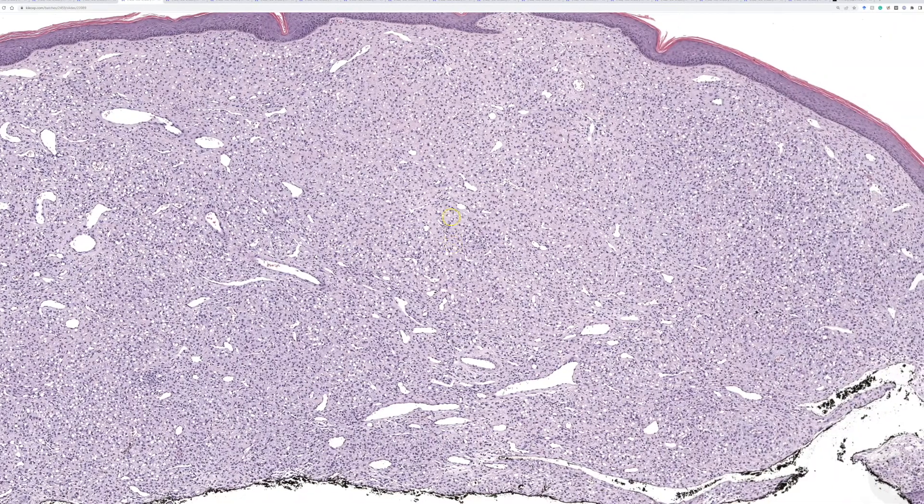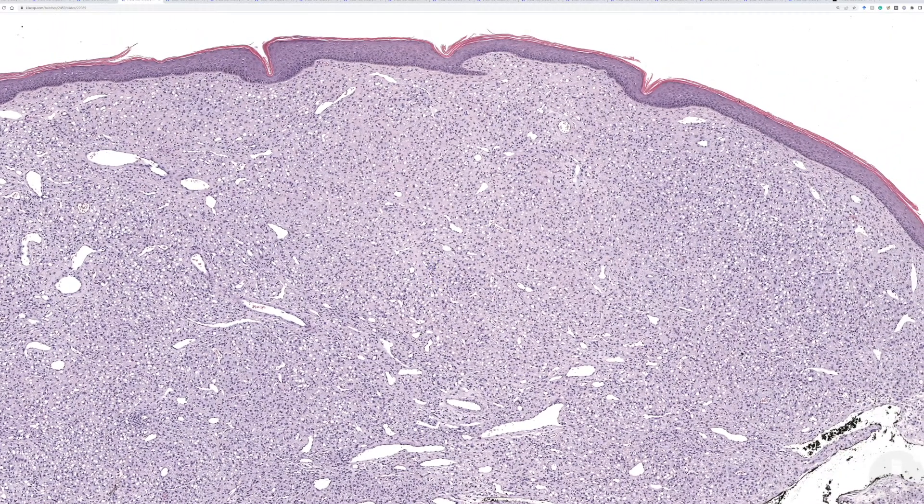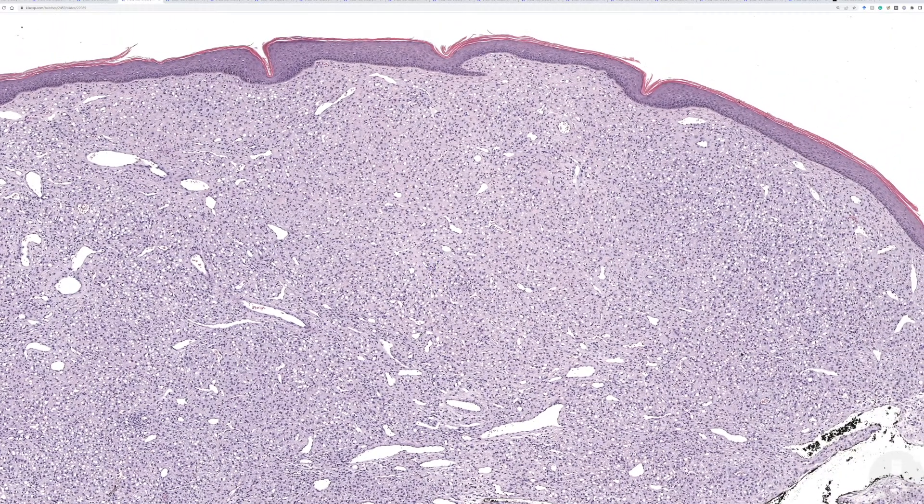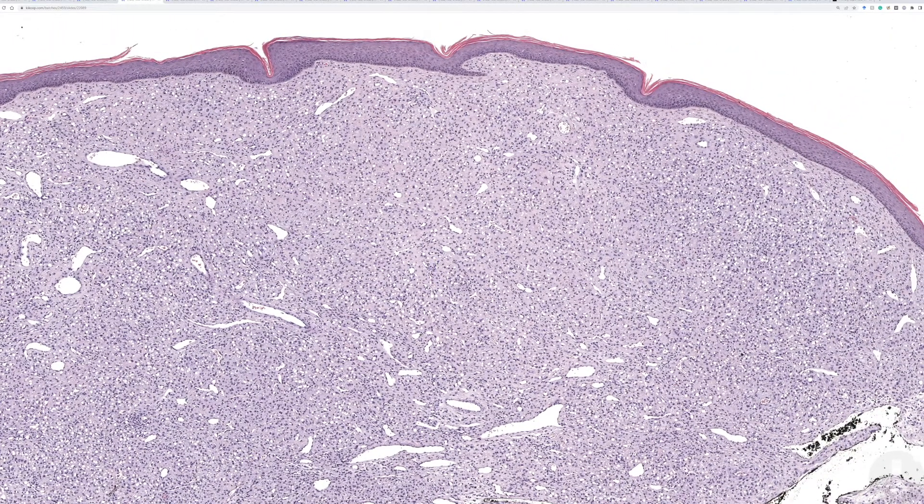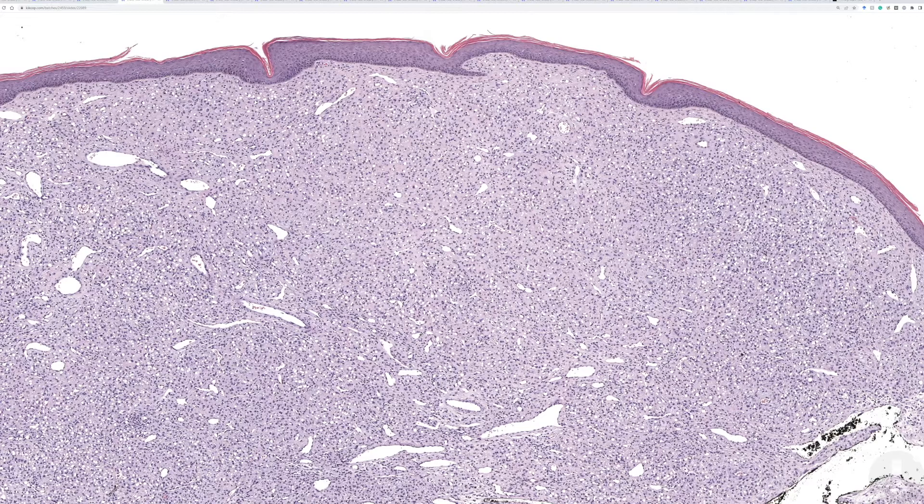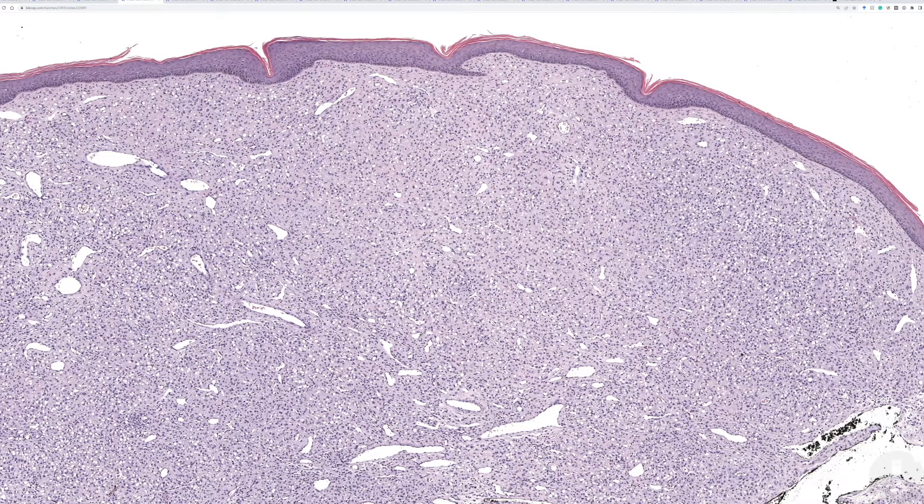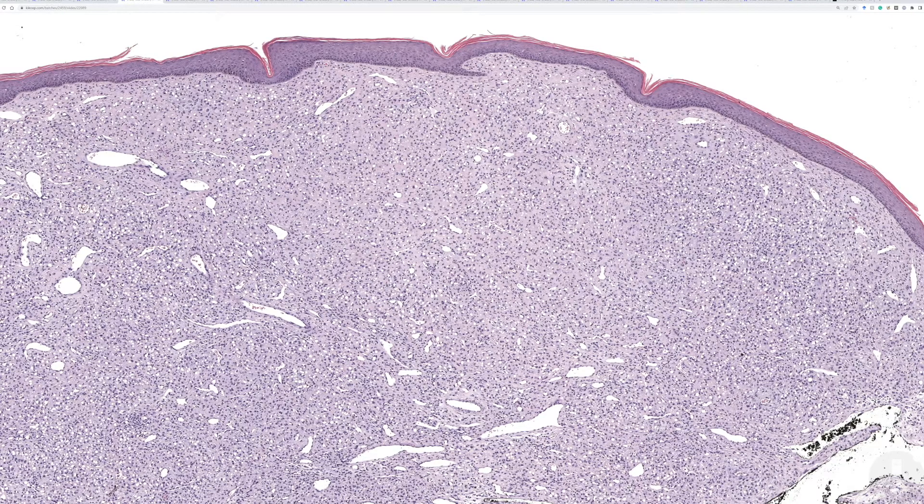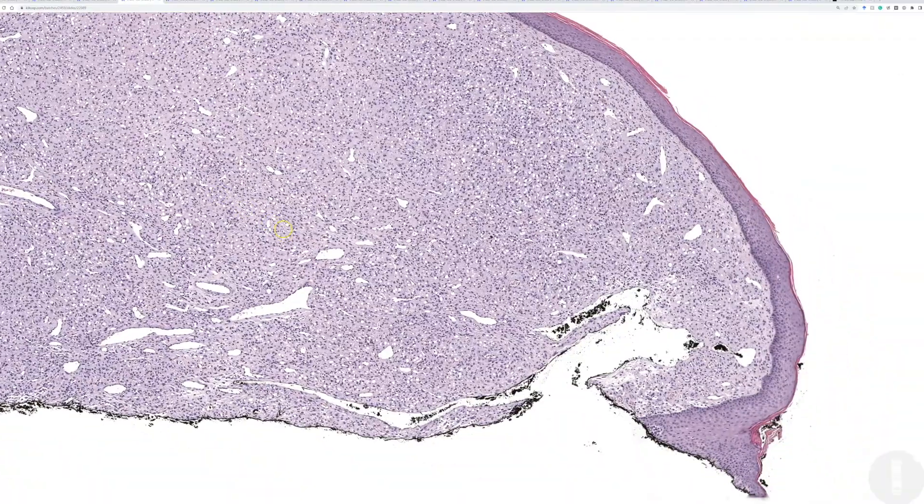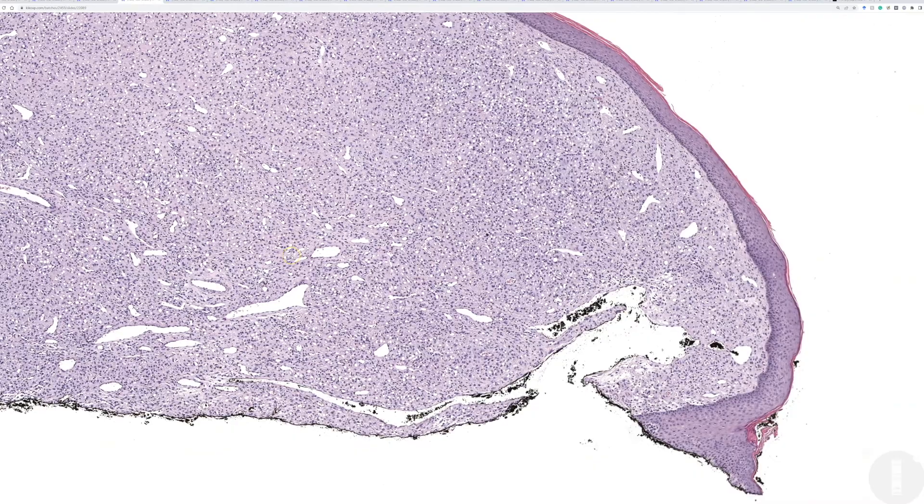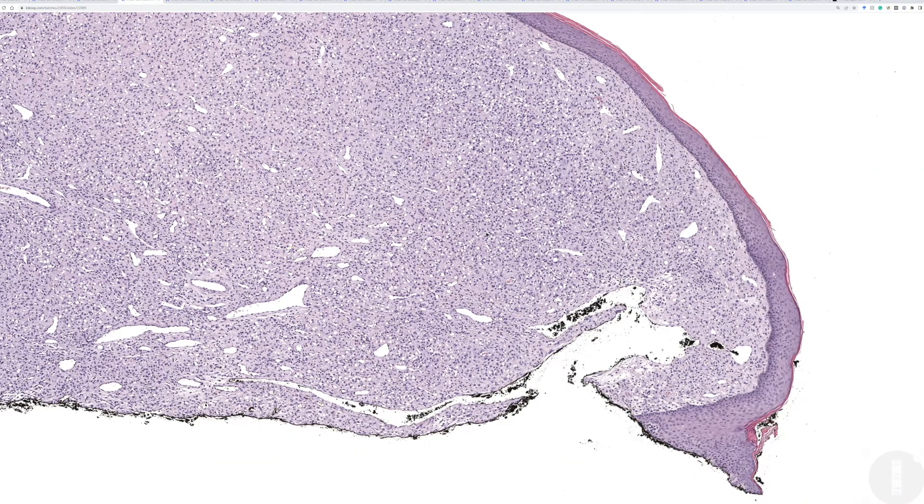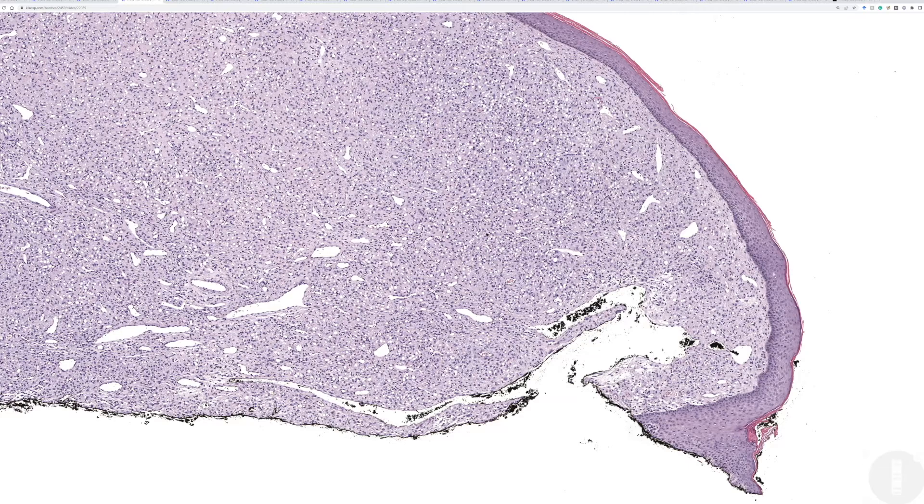When I was in fellowship, these were at the time thought to be a variant of dermatofibroma. And that never sat terribly well with me because they don't really look like a dermatofibroma. They're pushed right against the surface. They have a collarette. They don't have collagen trapping, usually. They don't really have any of the features that we typically see in conventional fibrohistiocytoma slash dermatofibroma.